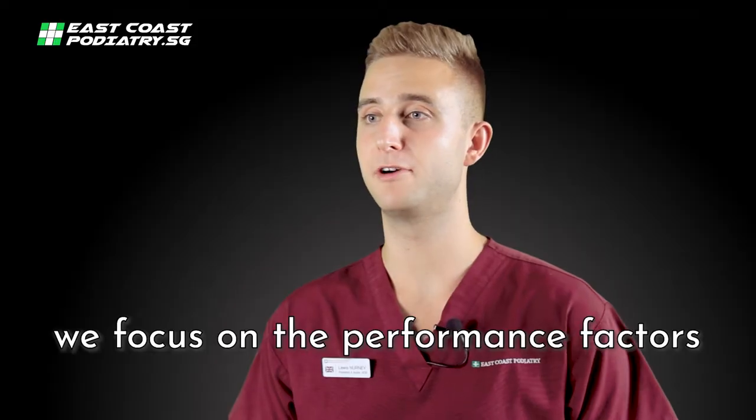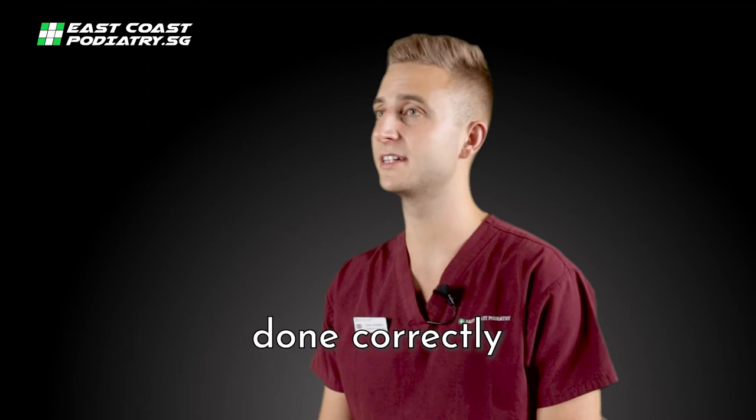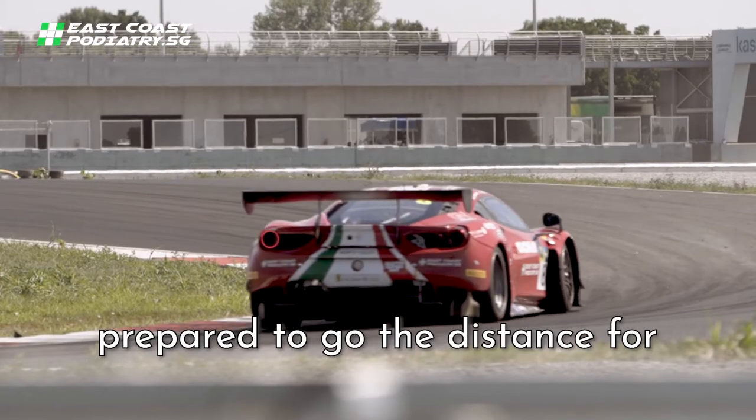As podiatrists, we focus on performance factors of the legs and feet. Customised foot orthotics done correctly is a complex clinical process. But this is a process that we are prepared to go the distance for.